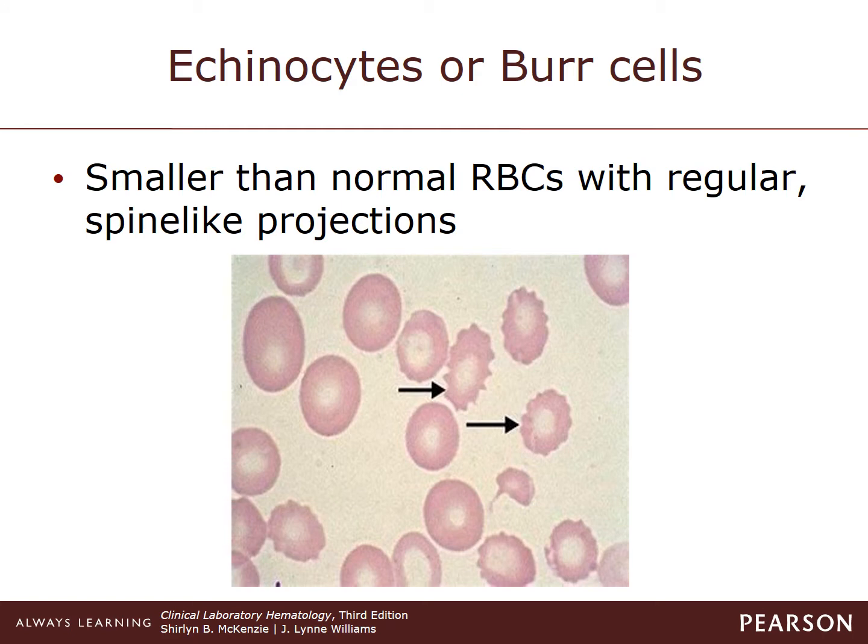Echinocytes, or burr cells, are smaller than normal red cells with a spiny-like projection evenly distributed all around the cell. The most common type of artifact is this burr cell and can be seen after the cells have been stored at 4 degrees Celsius for several days.